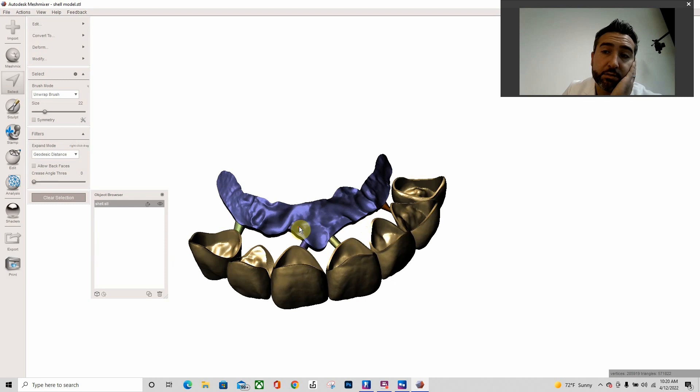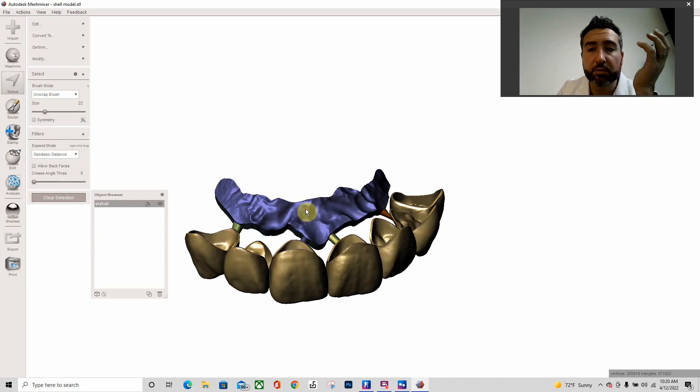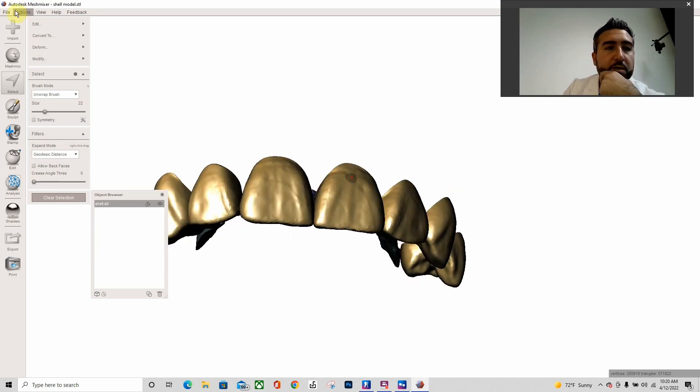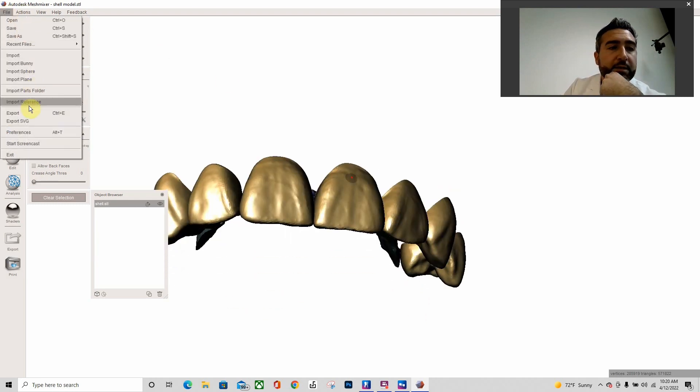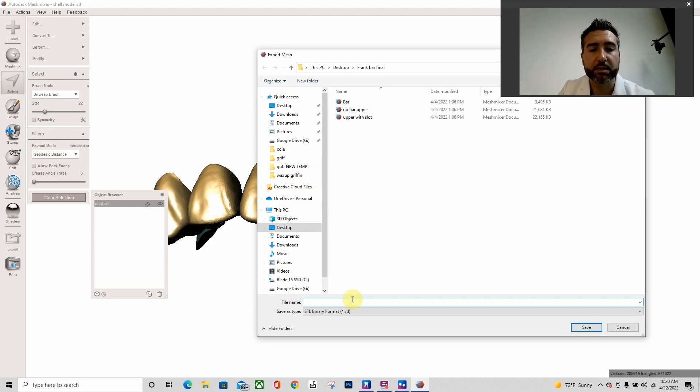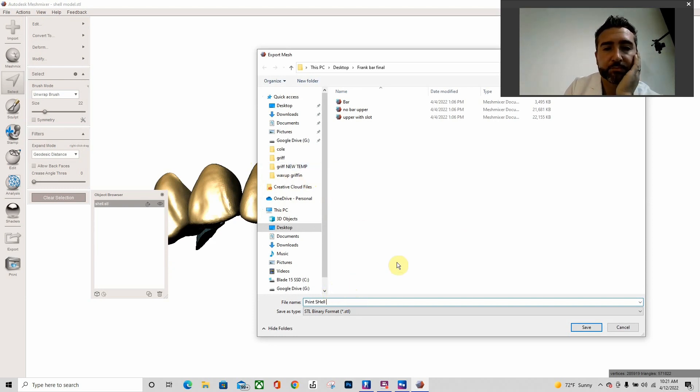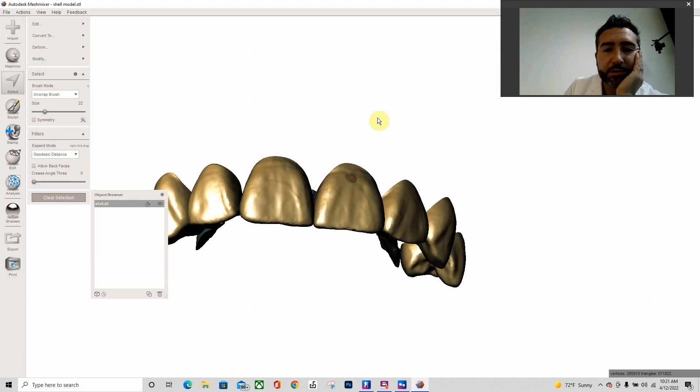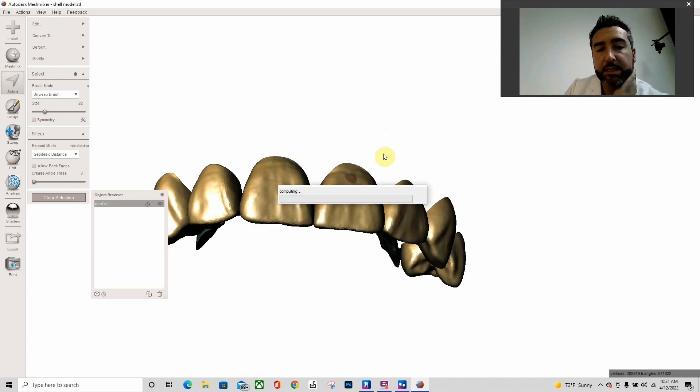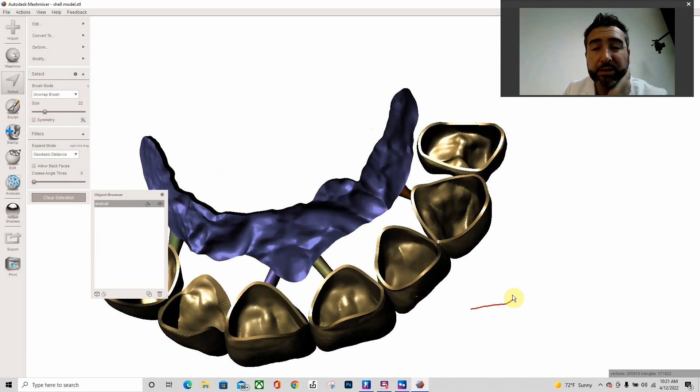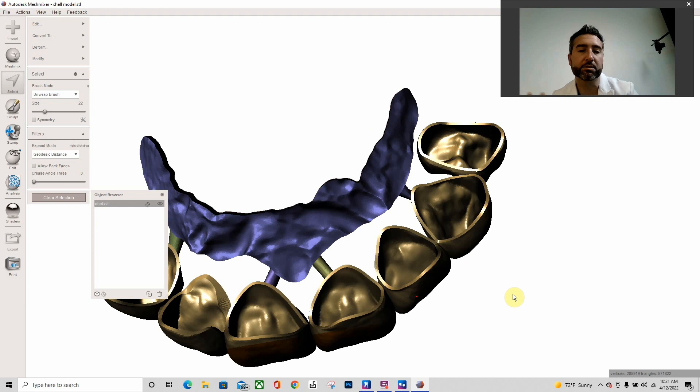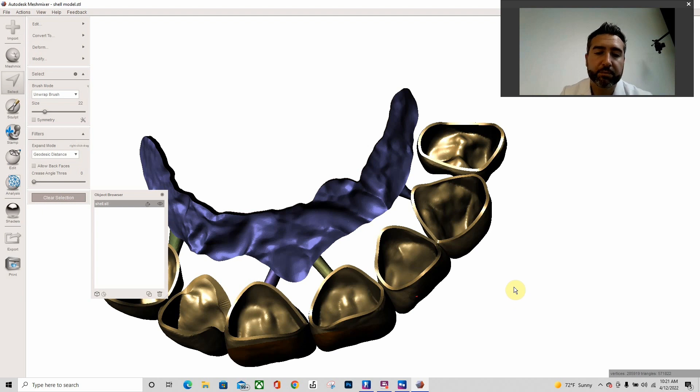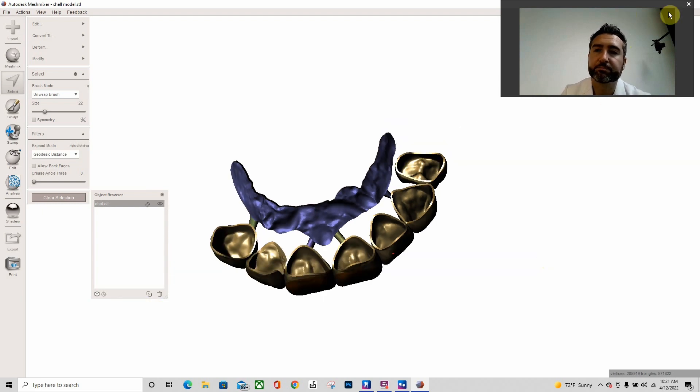I'm going to file export this as a print shell. Okay. Isn't that easy? In real time, when I'm not doing a tutorial, the whole shell provisional process is 10 minutes, maybe, maybe less. All right, I hope this helps.